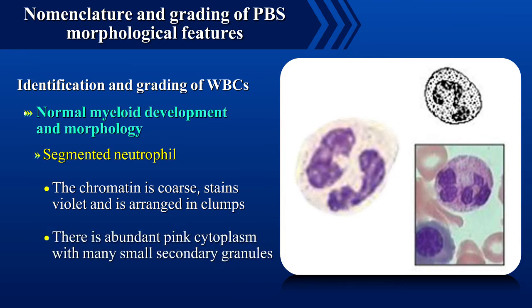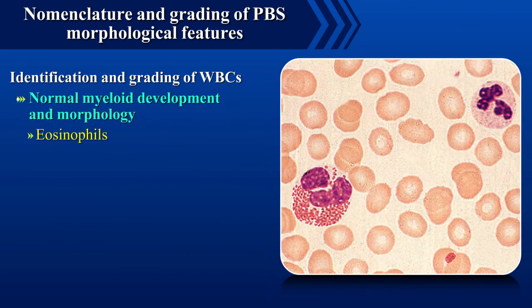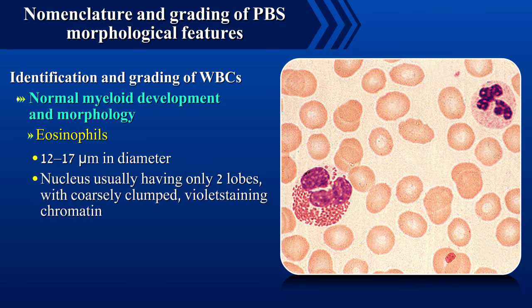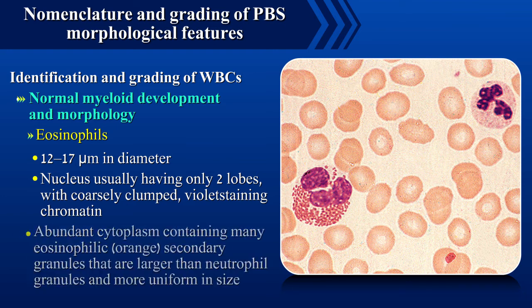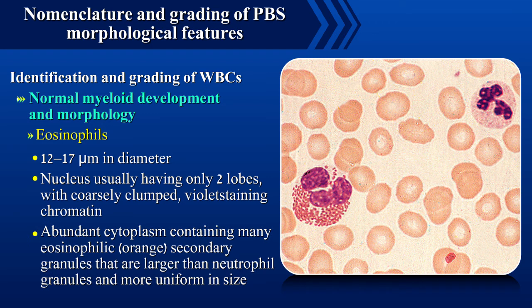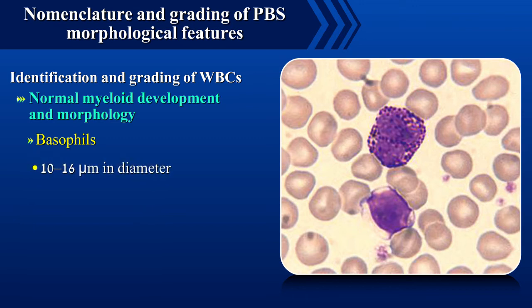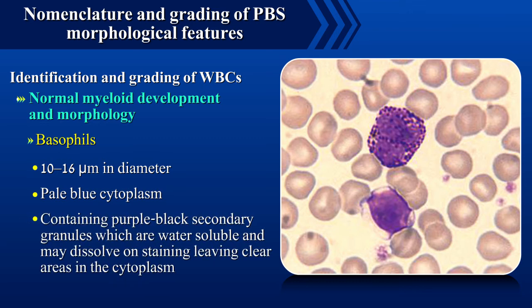There is abundant pink cytoplasm with many small secondary granules. Eosinophils are 12 to 17 microns in diameter with the nucleus having only 2 lobes with coarsely clumped violet staining chromatin. There is abundant cytoplasm containing many eosinophilic or orange secondary granules that are larger than neutrophil granules and more uniform in size.